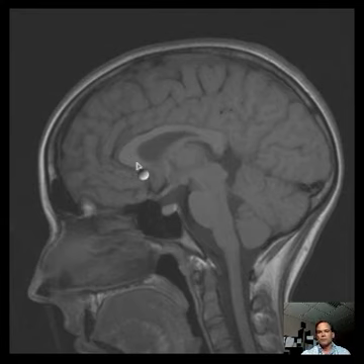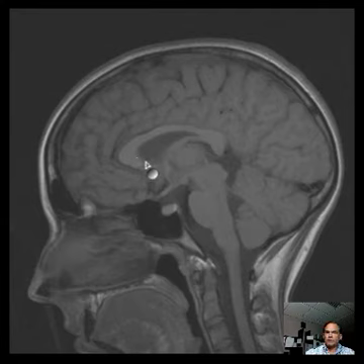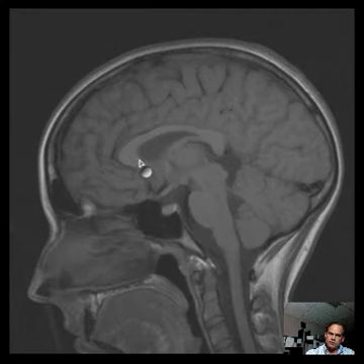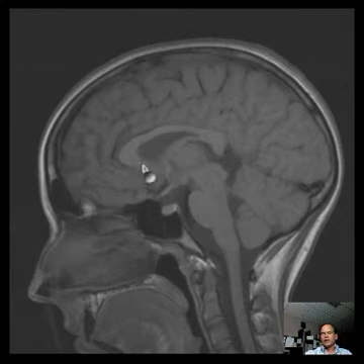It's the corpus callosum. The rostrum is right here — it's the most rostral part but it's kind of hooked around there. This is the genu, meaning the knee, kind of bent like a knee. This is the body, and this is the splenium. So: splenium, body, genu, rostrum — important parts of the corpus callosum.